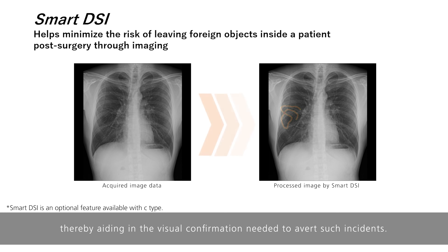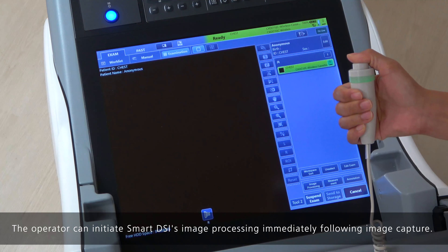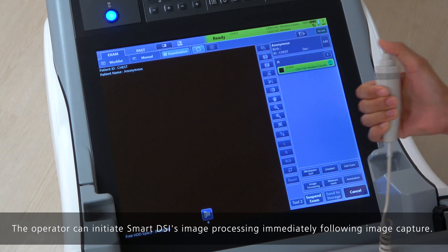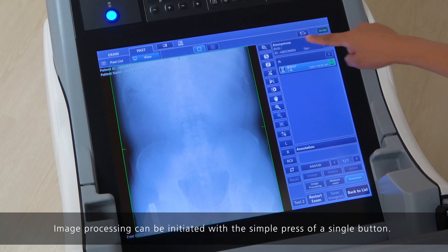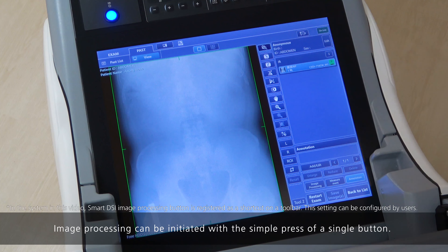The operator can initiate Smart DSI's image processing immediately following image capture. Image processing can be initiated with the simple press of a single button.